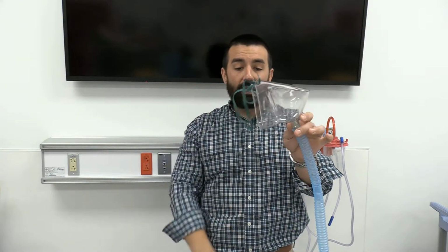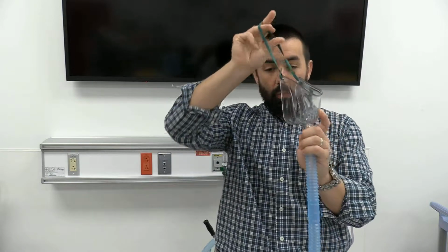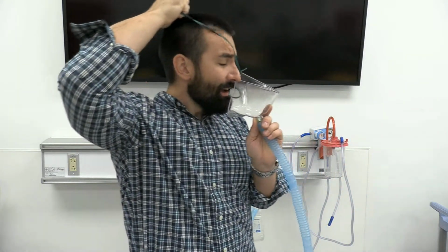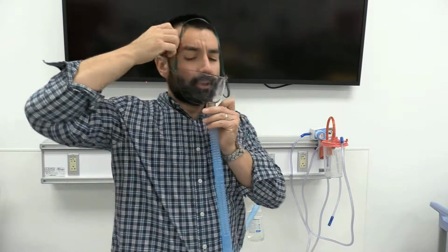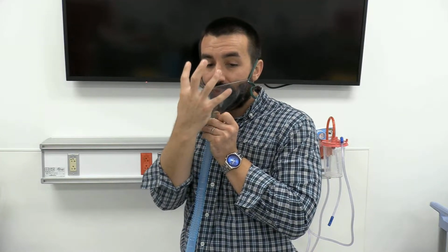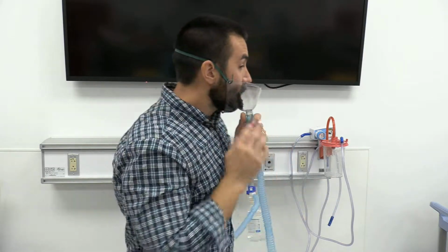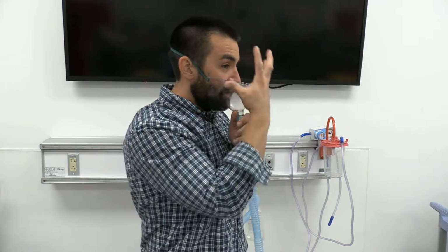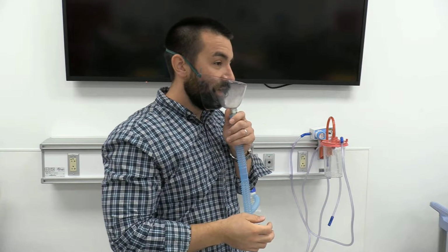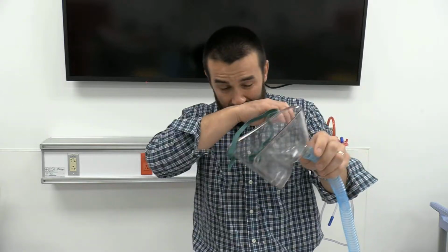All right, the biggest thing I'll tell you about the face tent is people put this thing on wrong all the time, okay? So think about it, you can see gas coming up right through here. Where do we want gas? We want that gas shooting right up to my nose and my mouth and kind of enveloping my face, so to speak, okay? You can see it's coming right up into my nose and my mouth, and I get a big cocoon of oxygen and aerosol and humidification kind of all around me. I probably shouldn't be breathing this. This actually isn't sterile water.